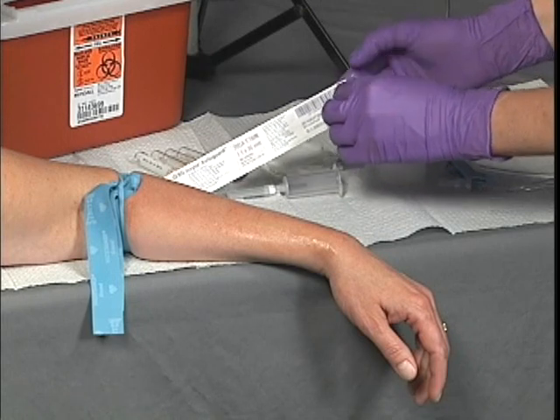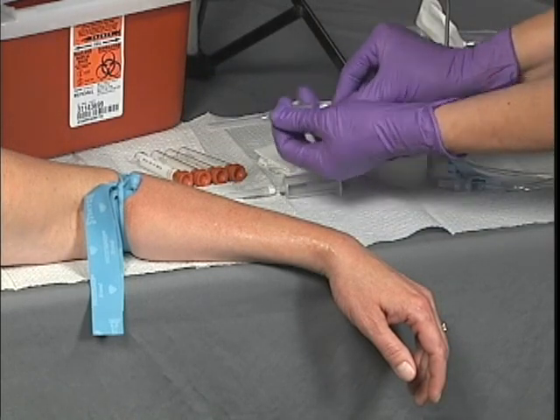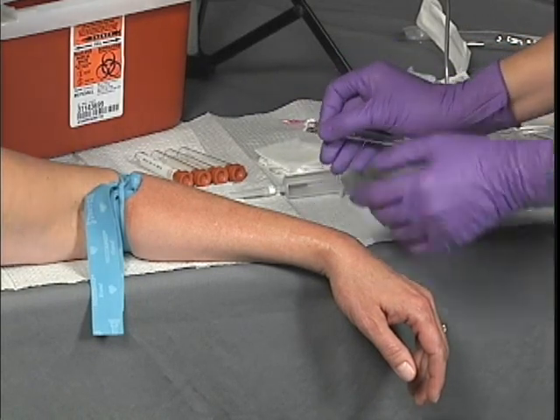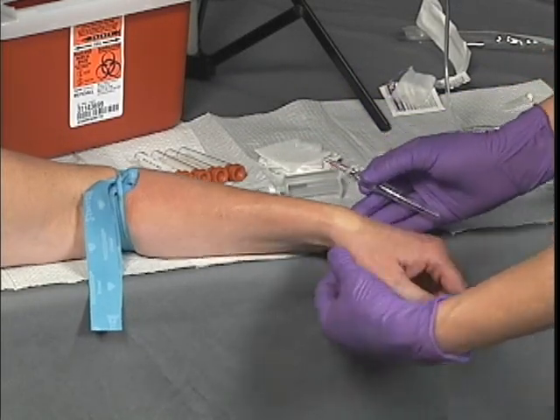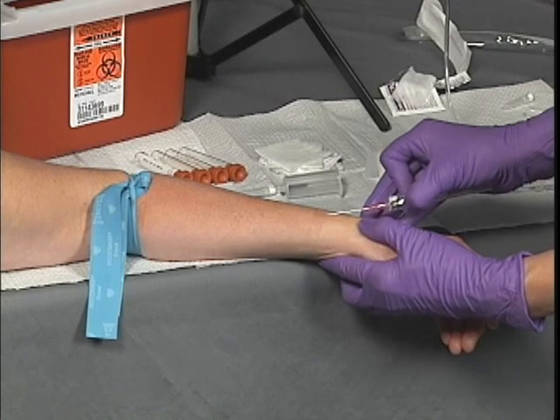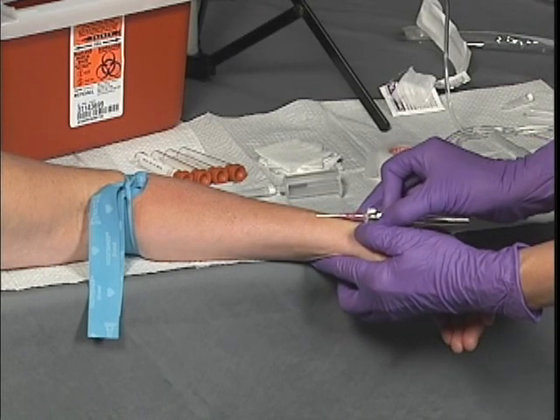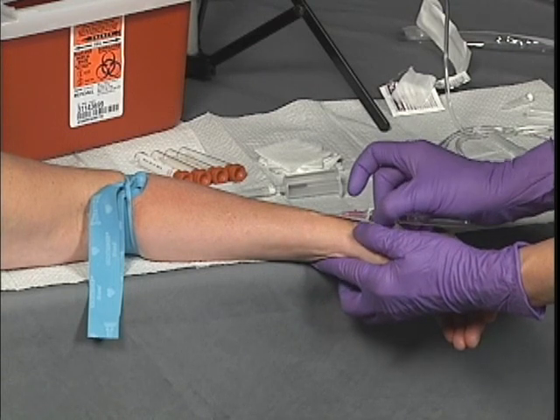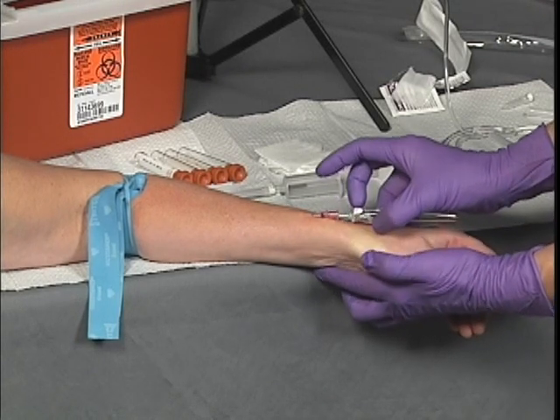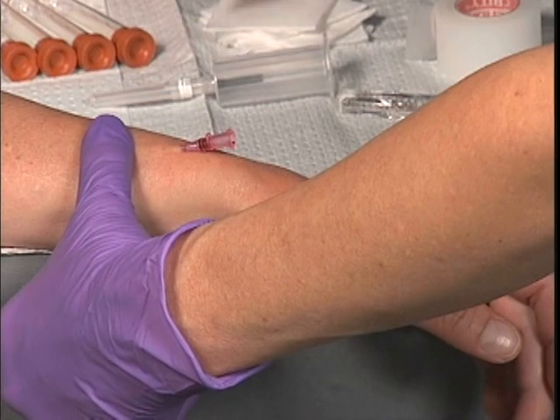Based on the intent of the IV and the size of the vein selected, choose an appropriate size IV catheter. Remove the catheter from its packaging and protective sheath. As an optional step, slightly twist the catheter to ensure it moves freely on the needle. Hold traction distally or circumferentially so the area is taut. Ensure the bevel of the needle is facing upward, then quickly but carefully enter the skin. A pop may be felt as the needle enters the vein. The flash chamber should fill with blood — note that patients with poor perfusion and small catheters will be slower to show a flash. Slowly advance the catheter along the needle until the hub meets the patient's skin.